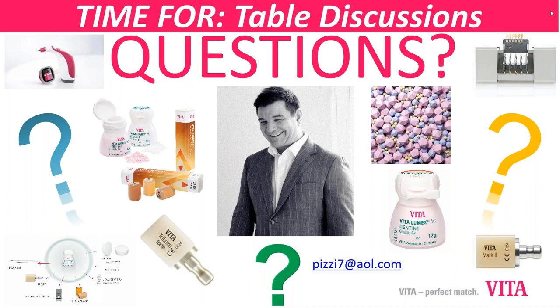Yeah, I mean, in an ideal world, why break contact if I don't have to? But I still want elbow prep, meaning that as I'm coming up from the gingival, I want to get a little deeper in there, make that elbow on the cervical area, and then come back out and keep your contact. But if your closing diastema is changing shape or form, you have to change the contact position.